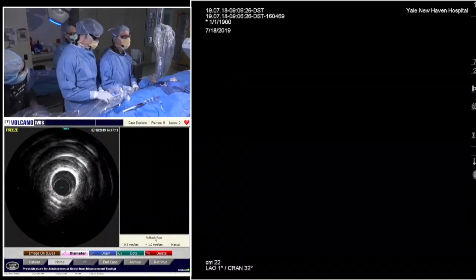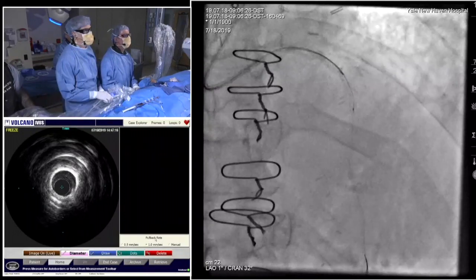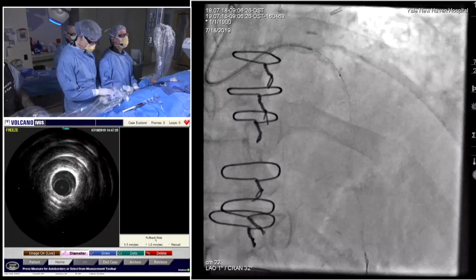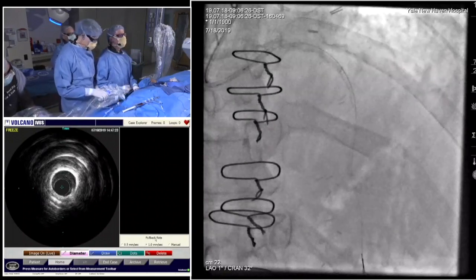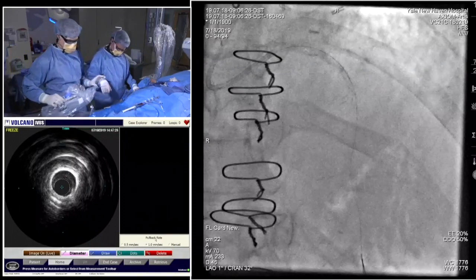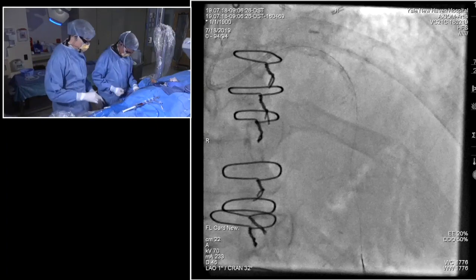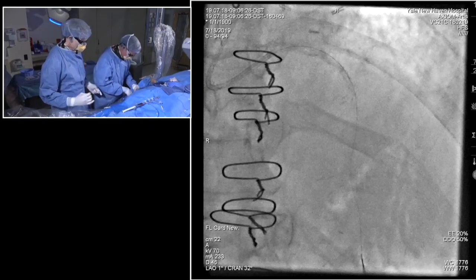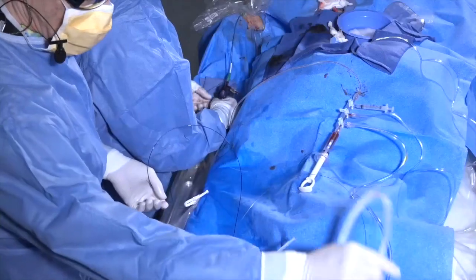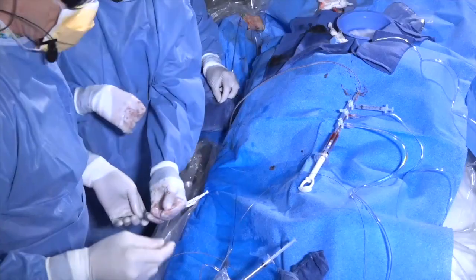The Revolution here is having difficulty getting around the corner. Yeah, I mean, typically you need to pre-dilate first. After atherectomy, an NC balloon is generally the next step. But this catheter is a rotational catheter from Volcano. Not many labs have it, but it works pretty well. The Revolution and the Refinity is a newer version. It certainly delivers better than the Eagle Eye. And these catheters, if they don't deliver, then you clearly are going to need to do dilation first.